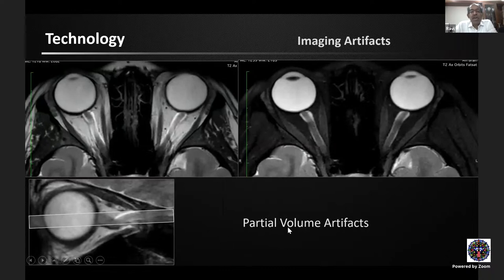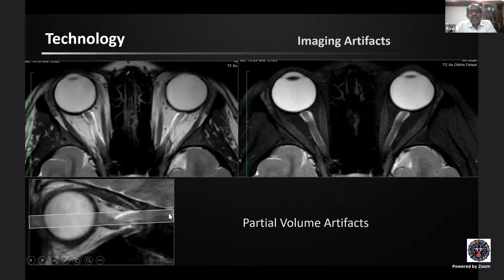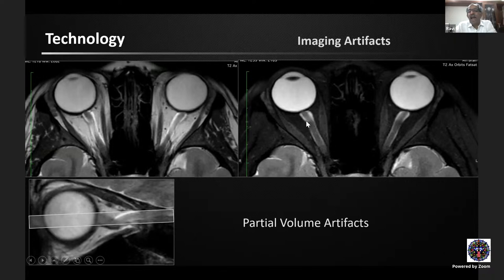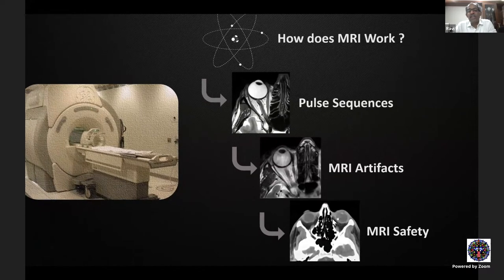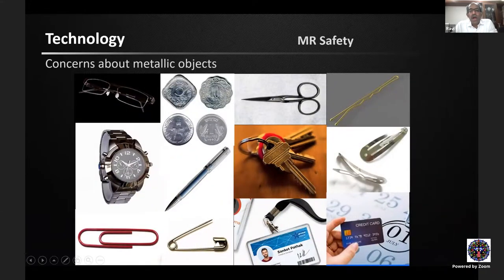Partial volume artifacts occur when thin structures like the kinked optic nerve are sampled with thick slices. Where the slice passes through a kink, part of the image contains optic nerve and part contains surrounding fat — this manifests as fat signal overlapping the optic nerve, appearing bright on T2 and dark on fat-suppressed T2. These should be recognized as normal artifacts and not mistaken for pathology.